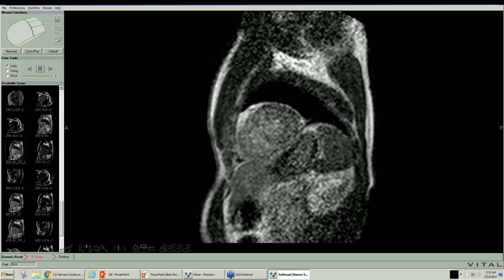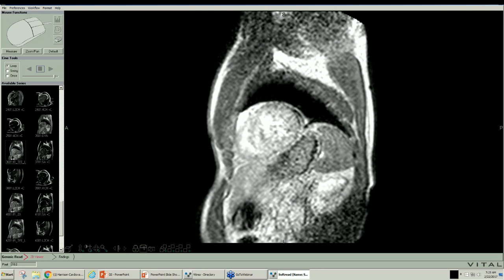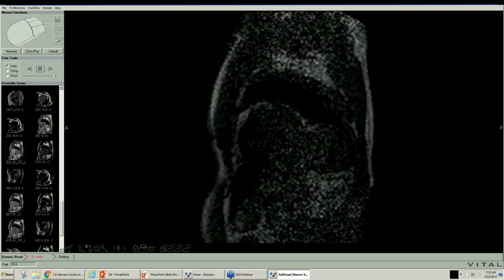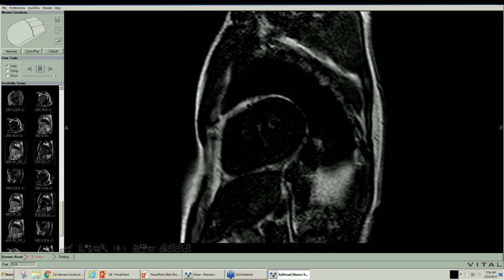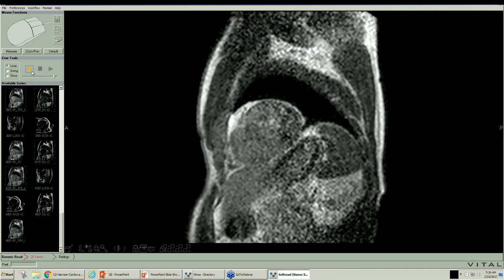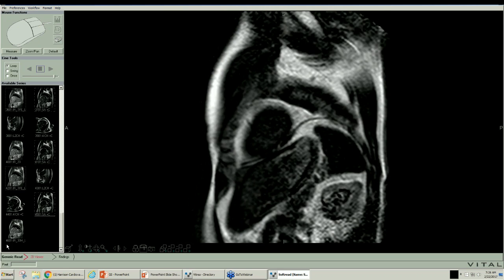We had difficulty with this one nulling and the case before nulling. And so we couldn't figure out if it was a function of the coil, function of the patient, function of the tech, but we can't make this whole thing black. It's not nulling correctly. This whole thing should be finally black, but we just can't quite get it where it needs to be. And so that is a problem. We talked to the tech. We looked at the equipment. We looked at the coil. We're trying to get a late gadolinium image. It's not working. And so we can't deal with this.